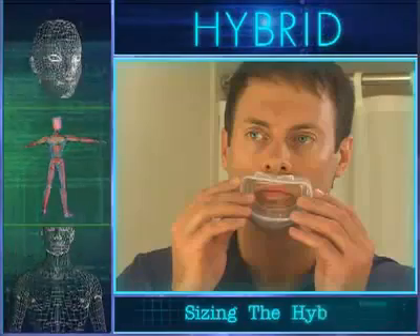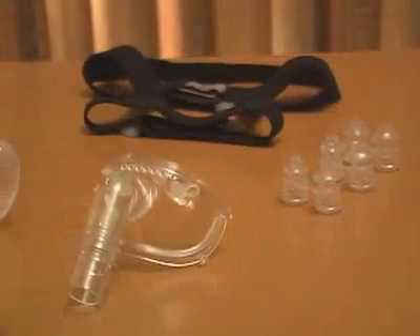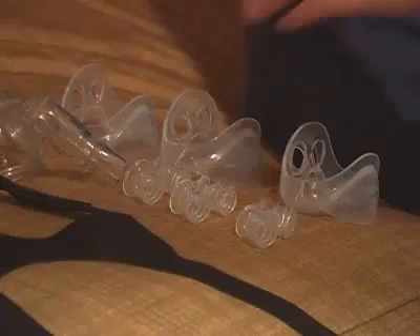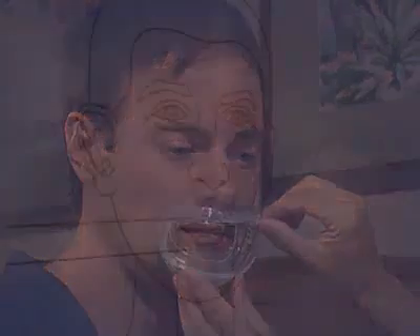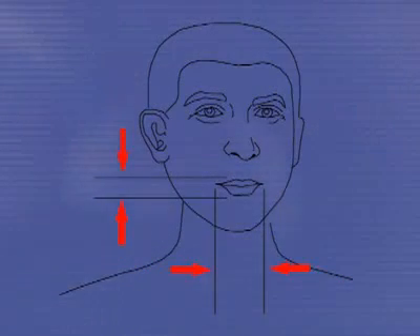To ensure optimal comfort and safety for the patient when sizing and fitting them with the hybrid universal interface, please follow the techniques provided in this video and in the instructions for use. To determine the appropriate oral cushion size, visually inspect the patient's mouth and choose a corresponding oral cushion. Place the cushion over the patient's mouth and inspect for adequate clearance around the lips. The upper section of the oral cushion should rest completely above the mouth on the upper lip, and the chin flap should fit under the patient's chin.